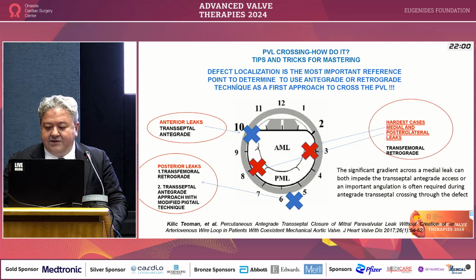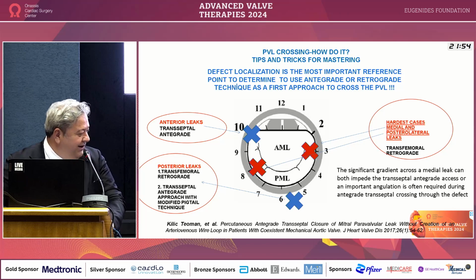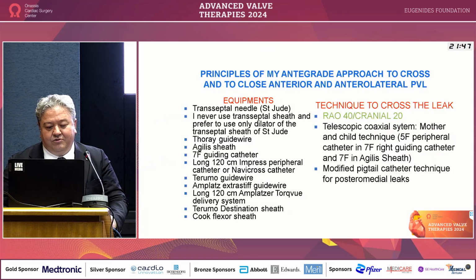But the hardest cases are the medial and posterolateral leaks. In the literature, many people recommend a transapical approach, but I always prefer to use the transfemoral retrograde approach first. These are the equipments: transeptal needle for the antegrade approach, mother and child technique.